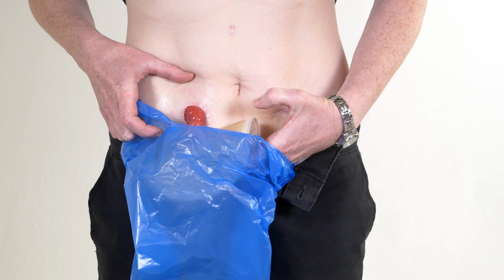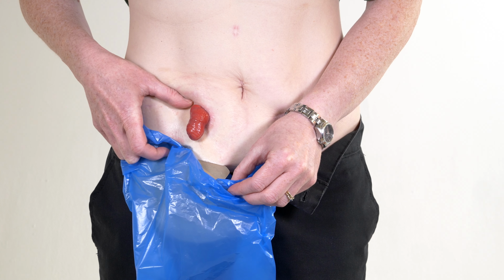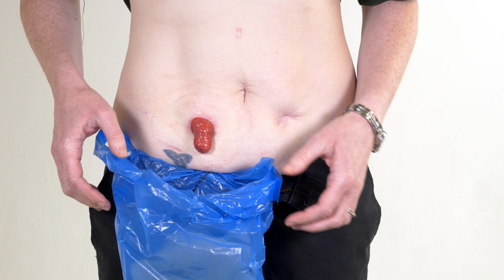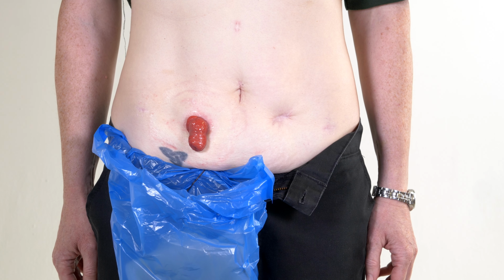Once the pouch is removed, fold it in half to seal it and place it into a disposable bag. These are available from your stoma supplier. You can then dispose of the bag in your normal household waste, along with any other supplies you use when changing your pouch, like wipes or cloths.